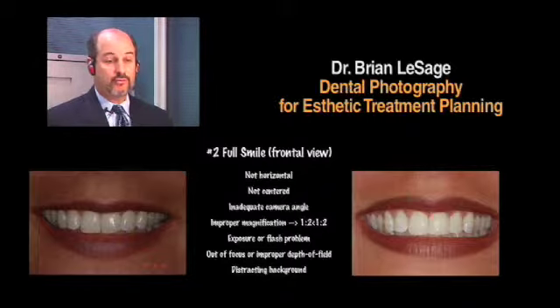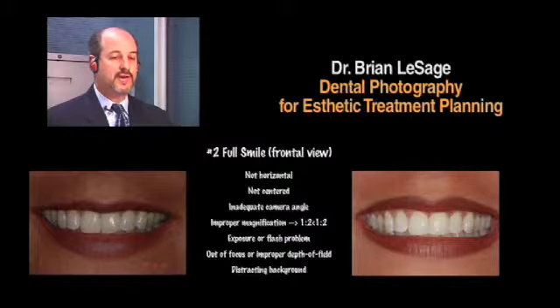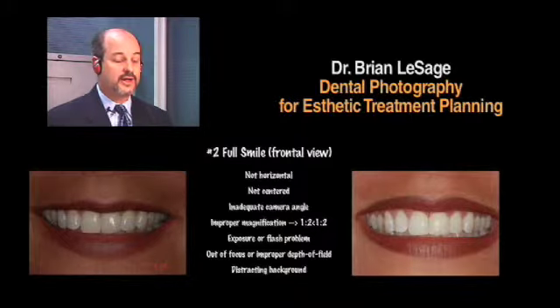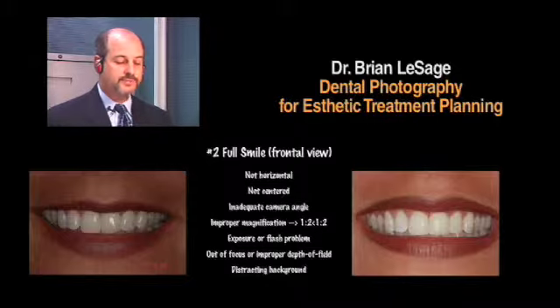All right? That would be good information, I think, that we'd all want to know. So be very careful with this view here, not to try to correct things for the patient. Shoot it with them in their natural horizontal head position, and you shooting parallel with the horizon. That's really the key. Have them seated up and shoot as best you can parallel to the horizon.